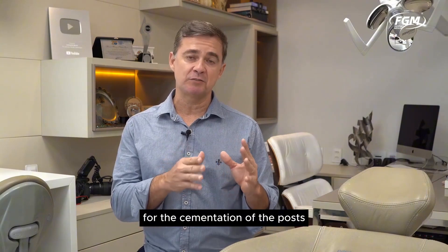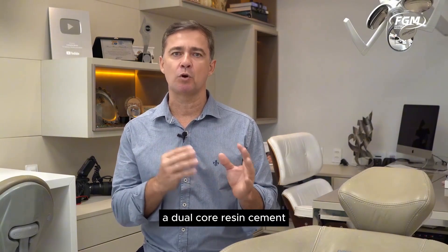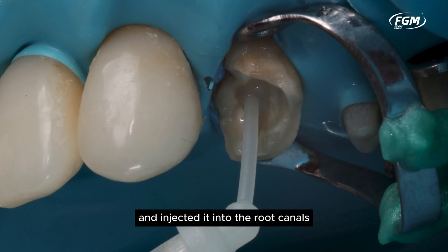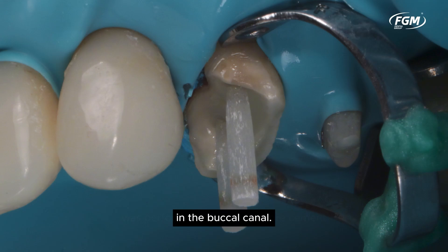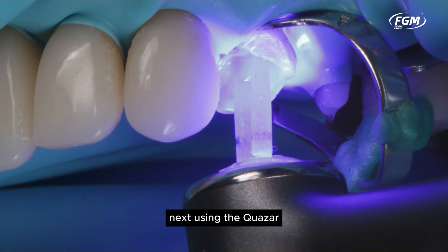For the cementation of the posts, we used Allcem Core by FGM, a dual-cure resin cement. Using an endodontic tip provided in the cement kit, we mixed the cement and injected it into the root canals. Observe the insertion of the fiber post in the palatal canal, followed by the insertion of the post in the buccal canal. In this occlusal view, the posts can be seen positioned. Next, using the Quasar, we photopolymerized for 120 seconds.